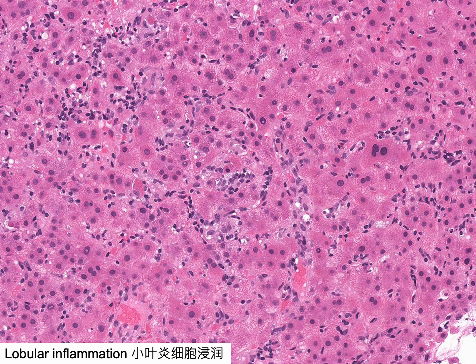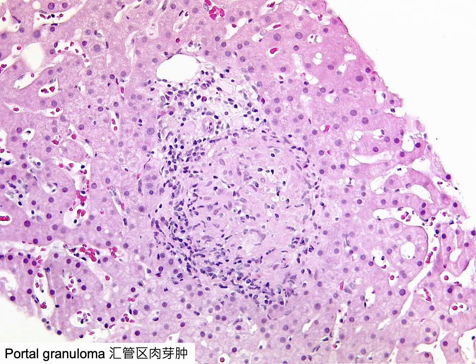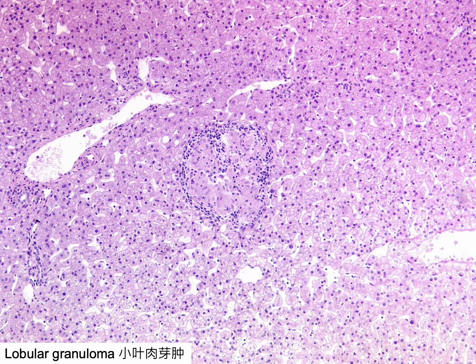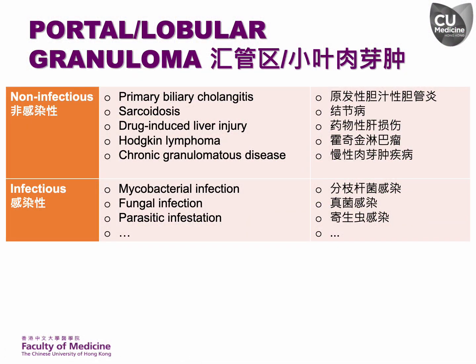This example shows prominent lobular inflammation featuring a significant number of mononuclear inflammatory cells infiltrating the sinusoids, with apoptotic bodies and foci of spotty necrosis also present. Granulomas may be well-formed non-caseating epithelioid granulomas or vaguely formed epithelioid granulomas, found in portal tracts or within the hepatic lobule. The primary differential diagnosis for portal and lobular granulomas includes infectious and non-infectious origins, with important non-infectious causes including PBC, sarcoidosis, and drug-induced liver injury.